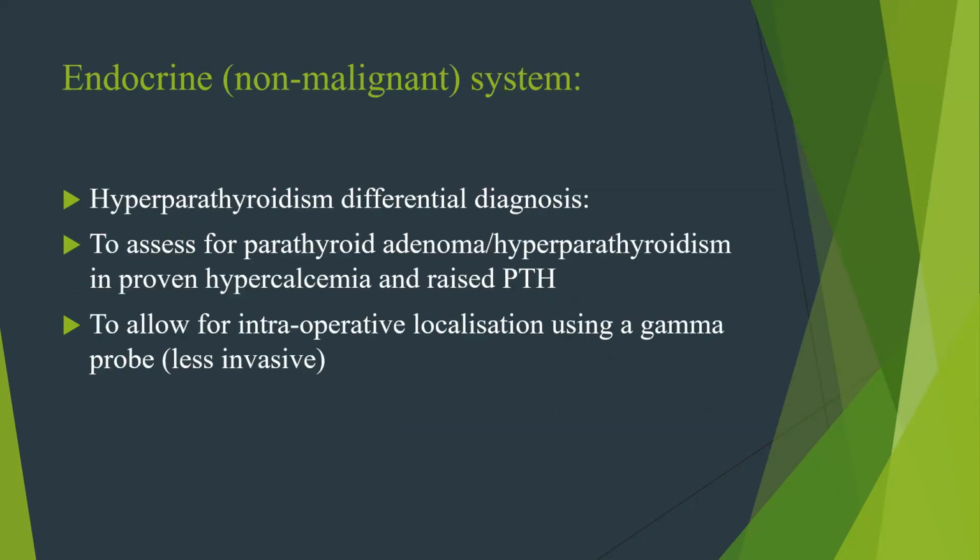Talking about the endocrine system, we also do hyperparathyroidism imaging, and we assess the presence of parathyroid adenoma or hyperparathyroidism in proven hypercalcemia and raised PTH. And this allows for an intraoperative localization using a gamma probe also, which is less invasive, and we can guide the clinician accordingly.